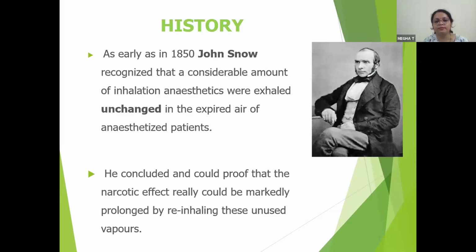So, coming to the history, as early as 1850, John Snow recognized that a considerable amount of inhaled anesthetics were exhaled unchanged in the expired air of the anesthetized patients. And he mentioned this in 1850 in the London Medical Gazette. He concluded and could prove that the narcotic effect could be markedly prolonged by re-inhaling these unused vapors. So when we say narcotic effect, we should not be confused with opioids. He meant that with respect to anesthesia, it could be prolonged.